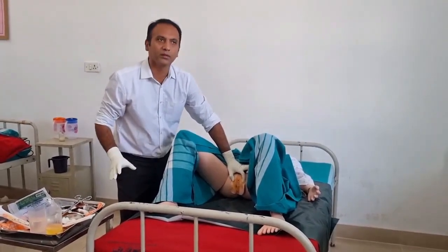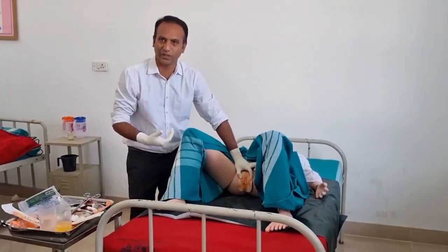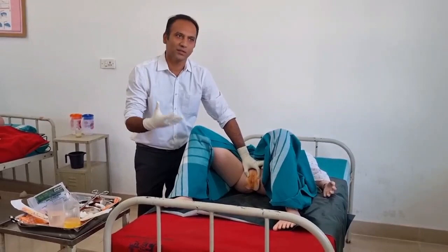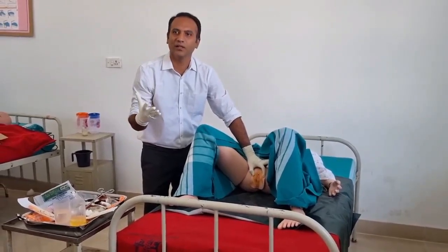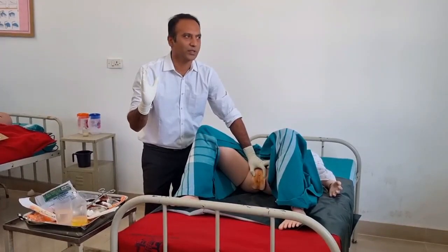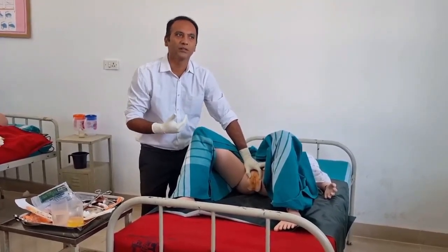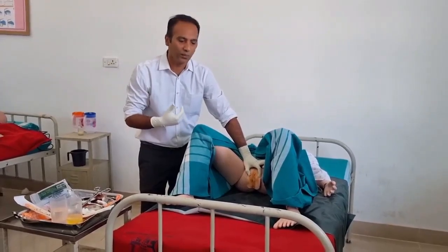Keep it in mind. Always stand on the right side of the patient, because some of the procedures are carried out with my right hand if I am a right-handed person. Okay, so if you are a right-handed person, stand on the right side of the patient.